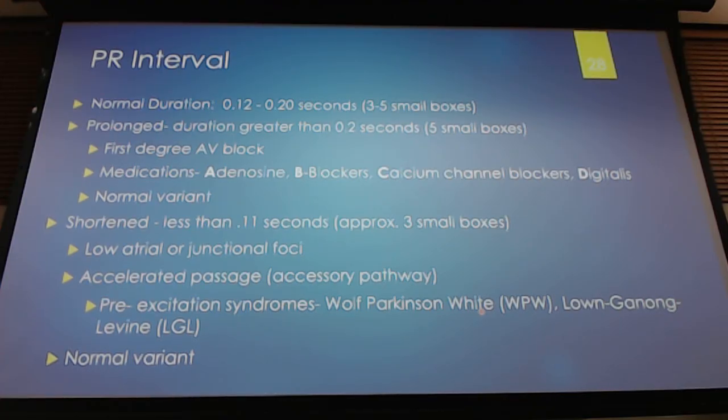Medications can change your PR interval. And again, it could be a normal variant. We like to see other EKGs to compare to. What is this patient presenting with? They're here for a flight physical. There's nothing wrong with them.